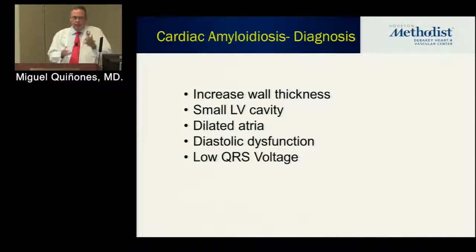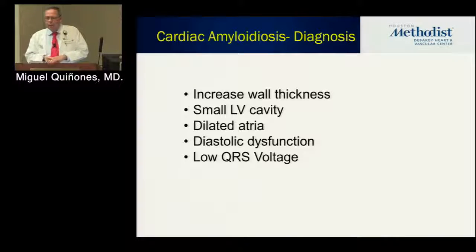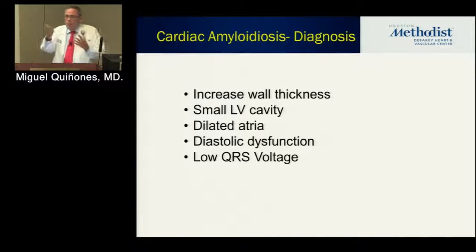Here we're privileged to have an excellent CMR, so obviously the echo report frequently says recommend cardiac MRI. But you may be in practice in a community later on that won't have that. So you're going to have to make the best you can then with the tools you have.